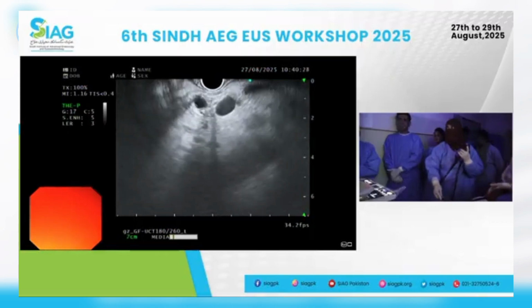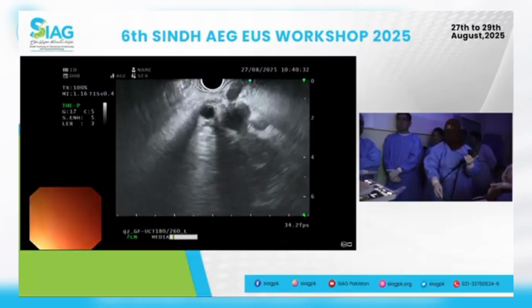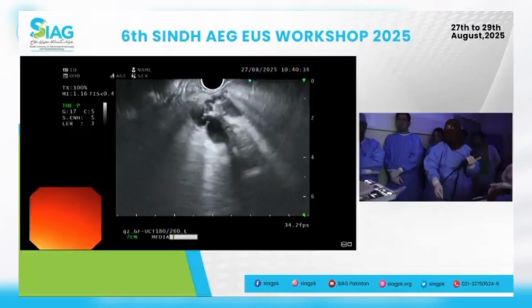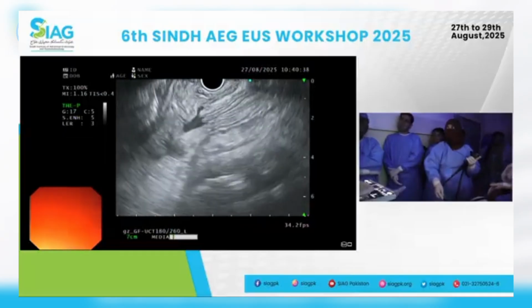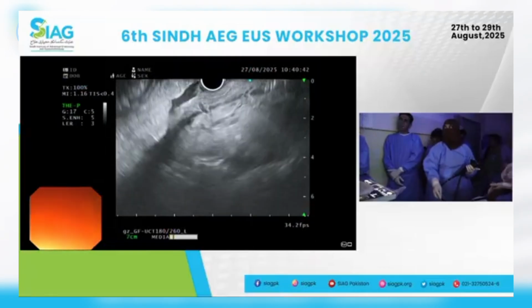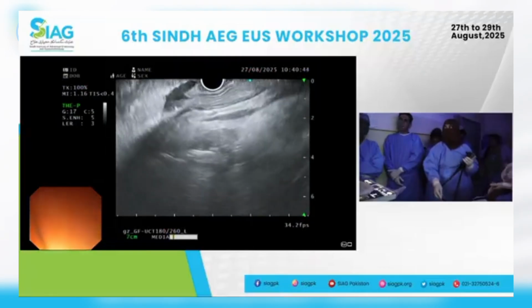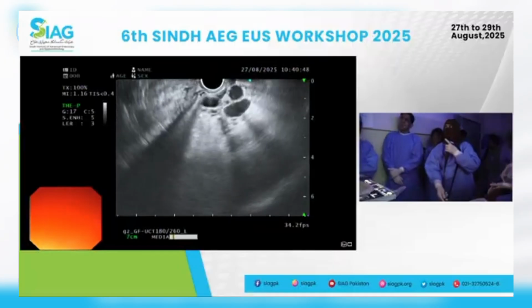Very nice, that's good. So keep scanning in the same plane. Again, undo it, go back. I think you just briefly saw the kidney there.